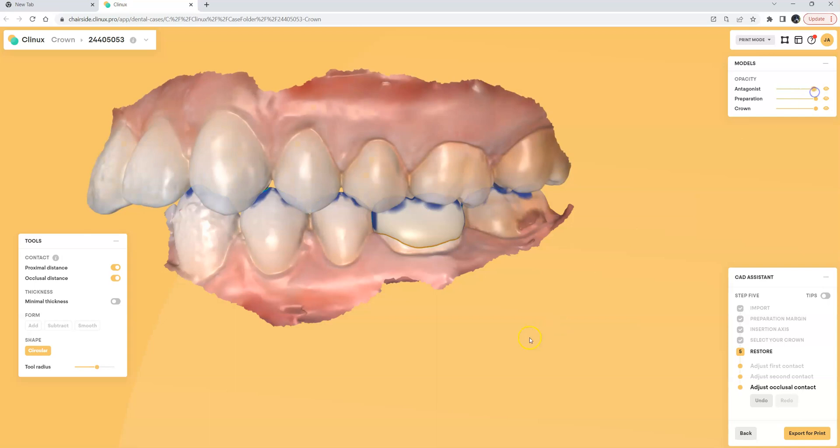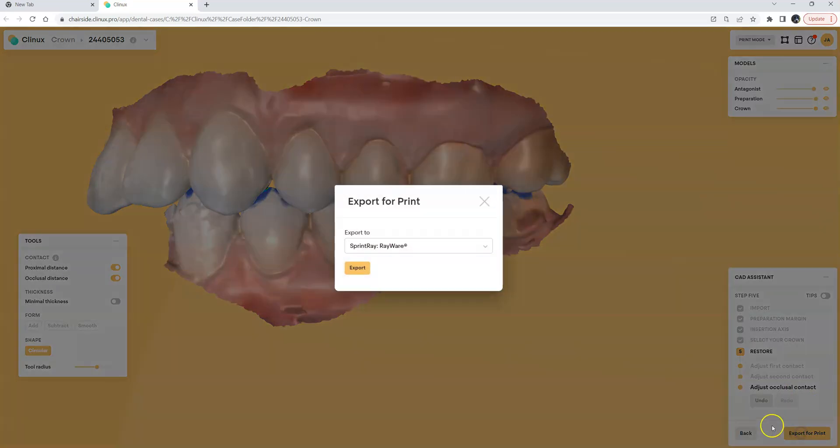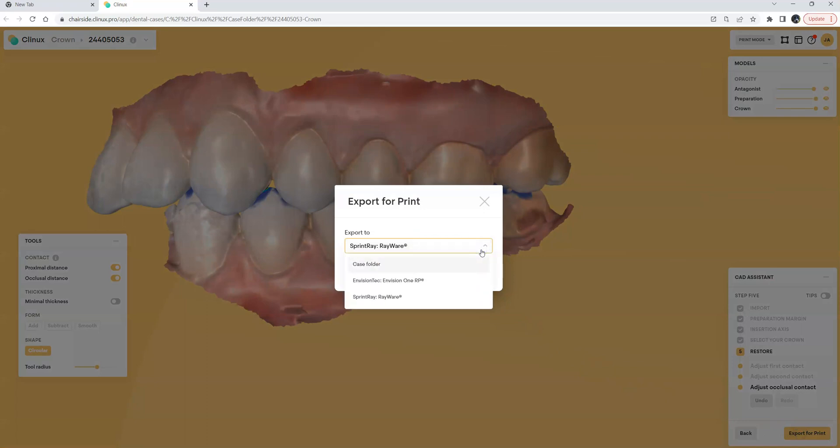Just like any CAD software it's pretty easy to navigate with the model tab up in the right hand corner and once the crown's been designed and we're ready to print it let's click export for print and because we've integrated with lots of different slicing softwares like Acureta, like Envision Tech, RP for the Einstein printer and Sprint Ray's RayWare.